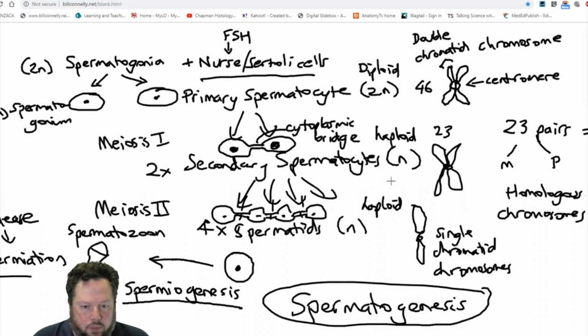All right, is there anything else I want to talk about with this? And we can begin to have a look at the structure of the seminiferous tubules. Does anyone have any questions about this before we move on?